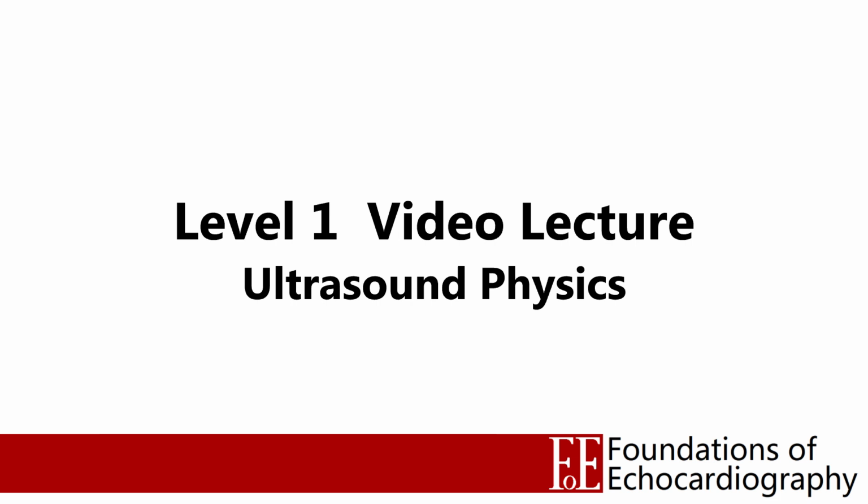So in this lecture we're going to talk about how ultrasound is used, how images are generated, and what some of the drawbacks of using this technology can be. Okay, so we want to make an ultrasound image, so we're going to need to start by taking an ultrasound probe. And this is a phased array probe, the type we use for transthoracic adult echocardiography.